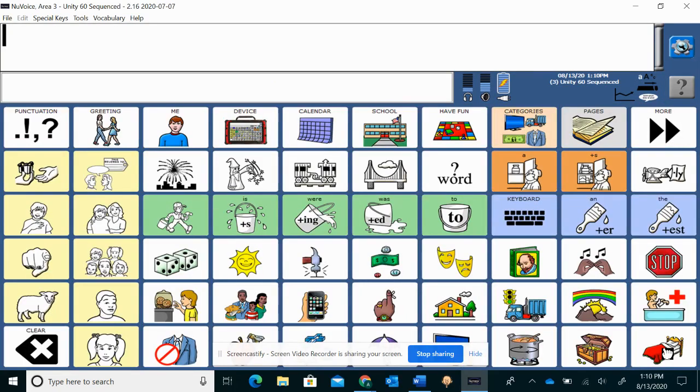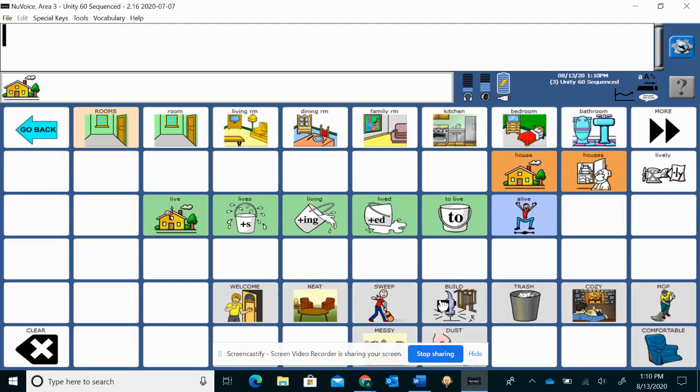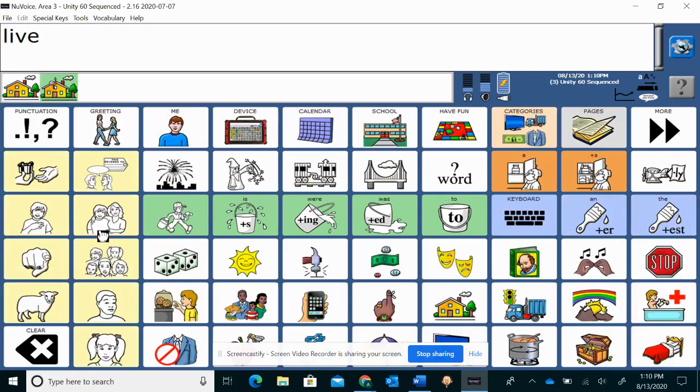And then here you see the difference. So Lamp had everything all at once. All 84 icons. Unity 60 Sequenced has 60 icons per page. The idea is the same. We push an icon. Goes to our action man.